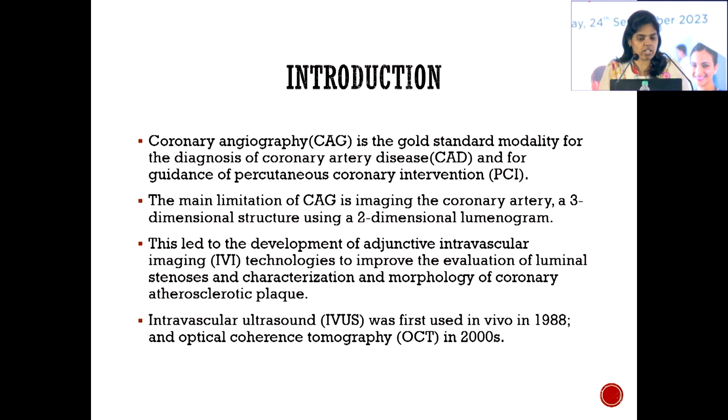So coronary angiogram, we know, is the gold standard modality for the diagnosis of coronary artery disease and for guidance of angioplasty. The main limitation of angiogram being that we are seeing a three-dimensional coronary artery in a two-dimensional way. So this has led to the development of intravascular imaging technologies, which include both IVUS, that is intravascular ultrasound, which I'm going to talk about, and OCT, which my colleague will be talking about next.